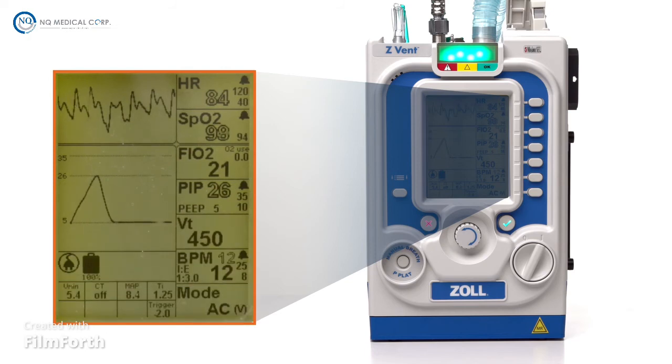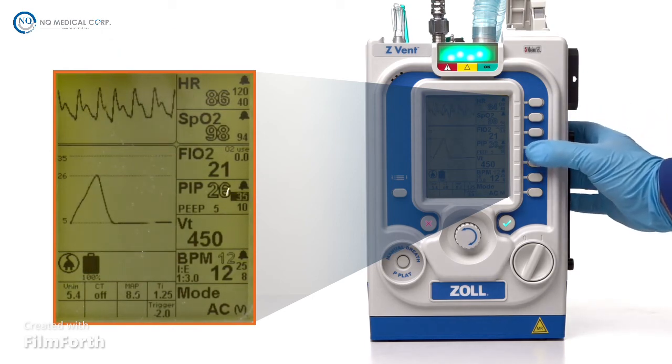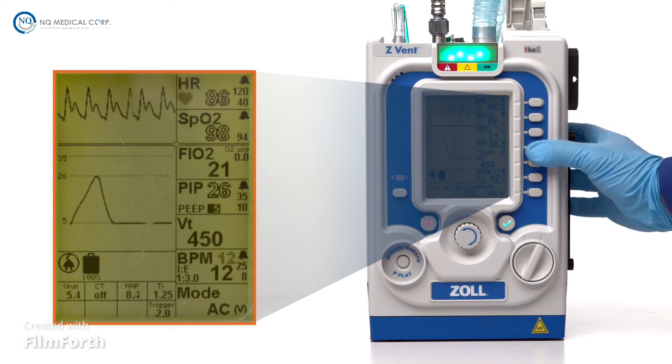To adjust a parameter, always remember the phrase, touch, turn, confirm. Begin by pressing the parameter button adjacent to the desired window. Notice how the setting within the parameter window is now highlighted. Each press of the parameter button cycles through each setting that can be changed for that parameter. Use the parameter button to cycle through settings until the desired value is highlighted.